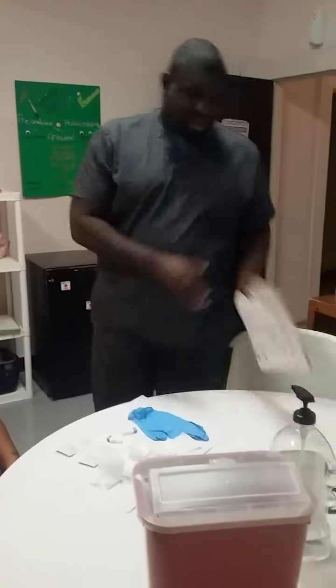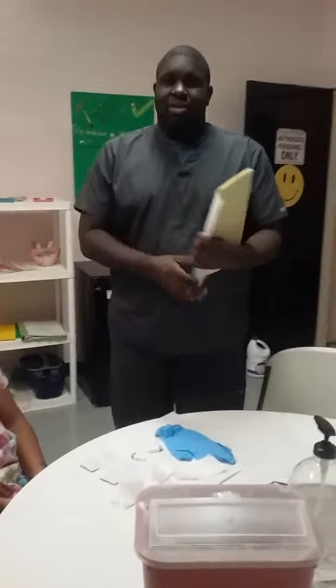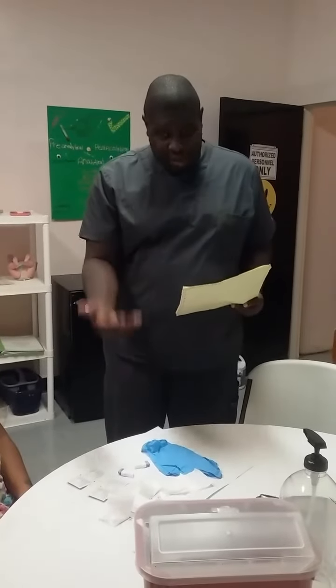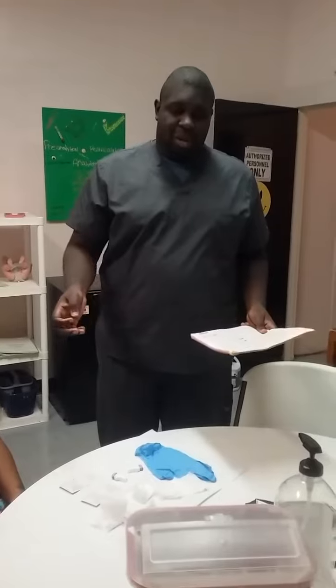Okay, here we go. Now, the first thing you want to do is check this. This is called the requisition form. This will tell you exactly what the physician wants done to the patient. It will also have the patient information on it, and any other pertinent information that you'll need for the procedure you're about to do for the patient.